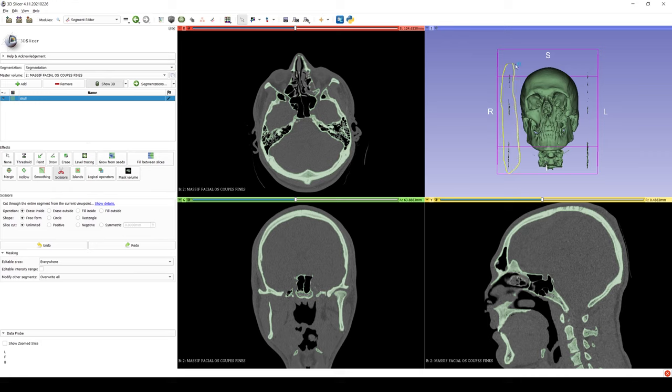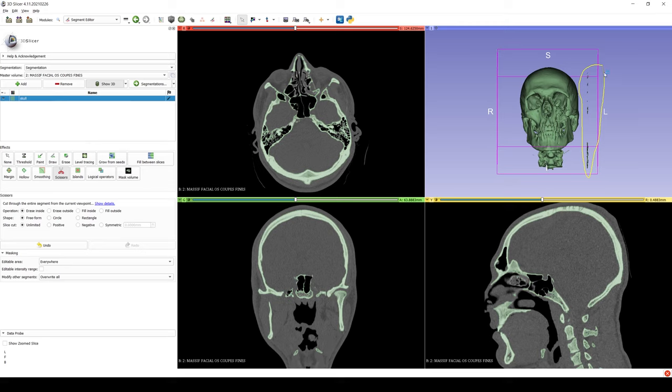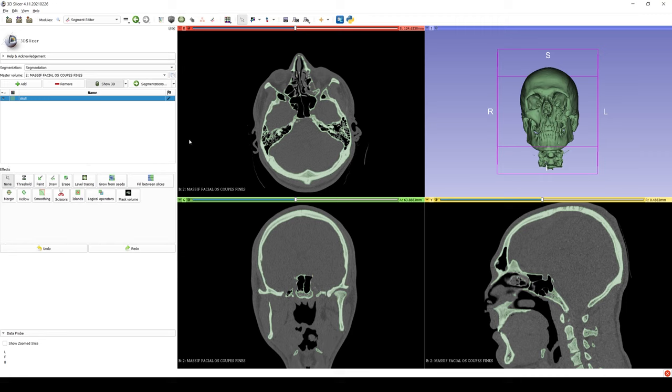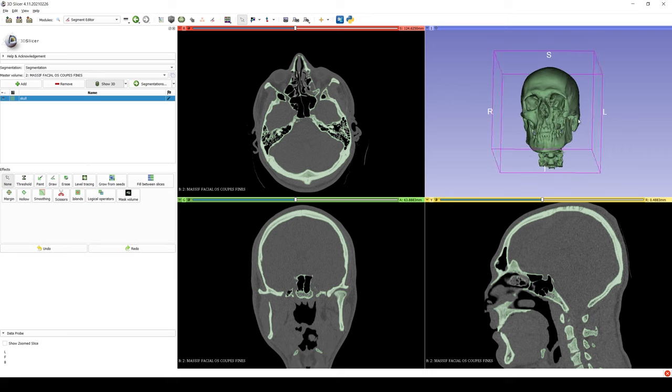Simply left click your mouse and drag it around whatever is to be removed. Now if we want to move the model around, we go back to the left side toolbox and select None. Now we can move the image around.